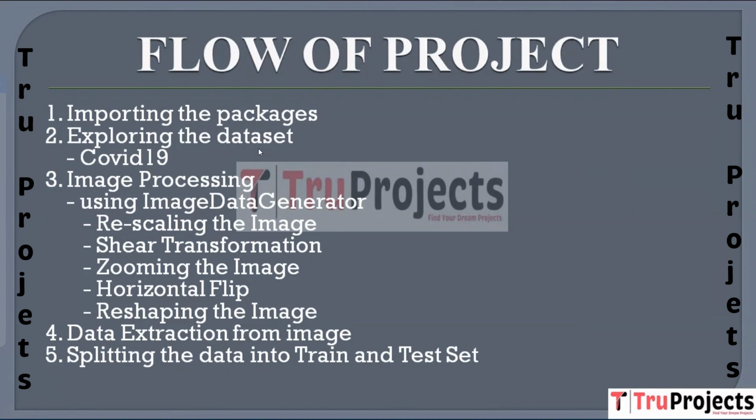Second, here we have exploring the COVID-19 dataset. Here you load and explore your dataset, which contains information related to COVID-19. This may include statistical analysis, data visualization, and data pre-processing tasks to understand the dataset structures and characteristics.